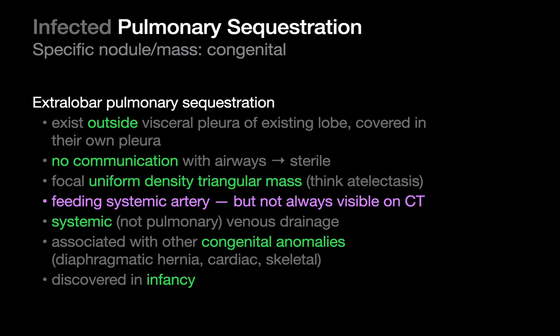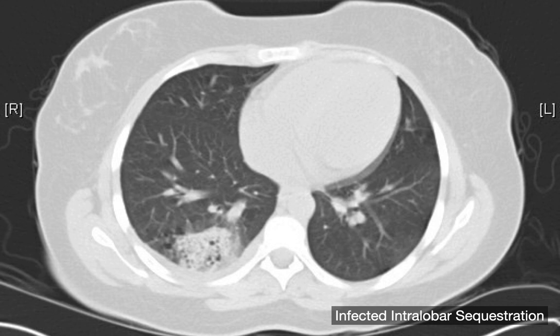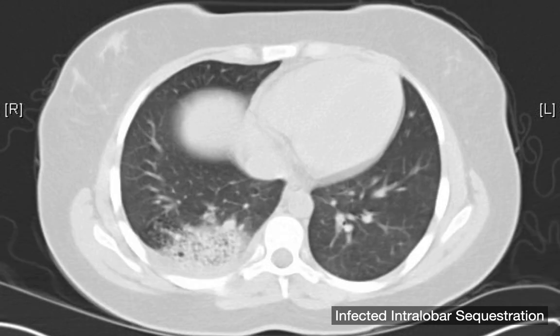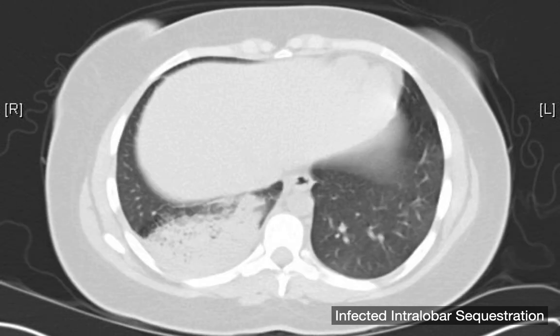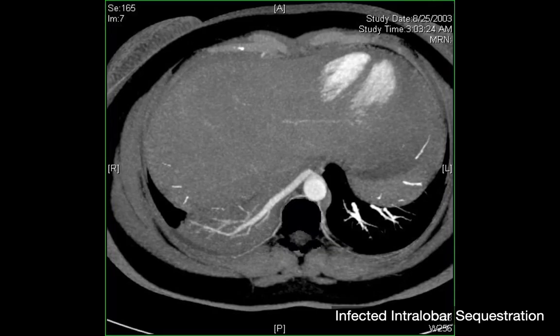Their natural history is a little different than intralobar sequestrations — extralobar sequestrations tend to be associated with congenital anomalies more often, and as a consequence may be discovered in infancy. Here's an example of an infected intralobar sequestration. It looks like a mass, but there's a bubbly texture associated with it, kind of like a dish sponge, which is highly unusual. On soft tissue windows, we can actually see a blood vessel feeding this lung mass supplied from the descending thoracic aorta — highly specific for an intralobar sequestration.